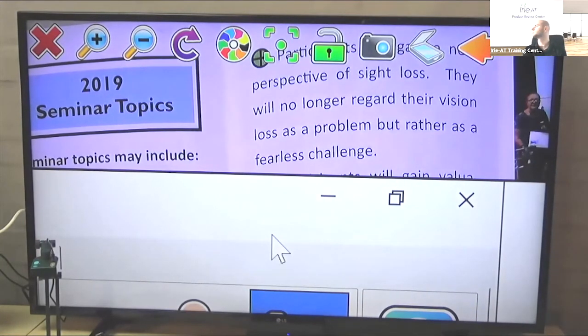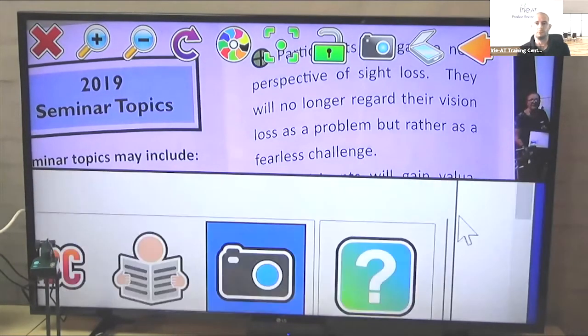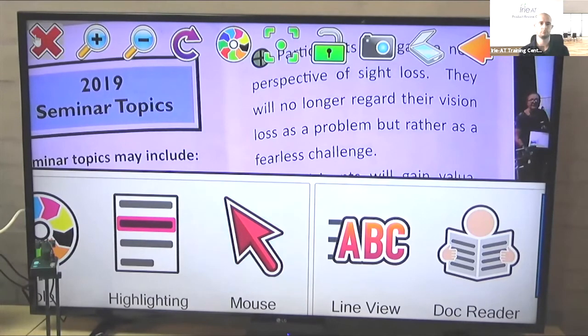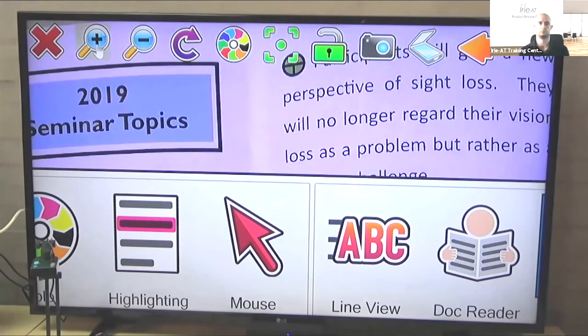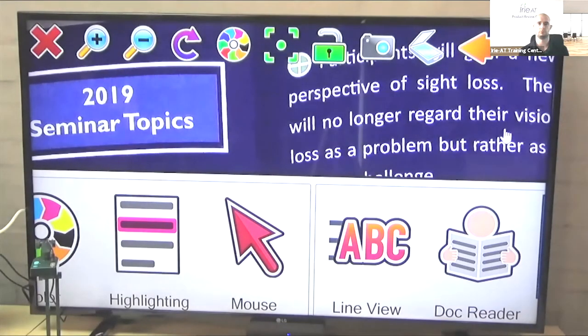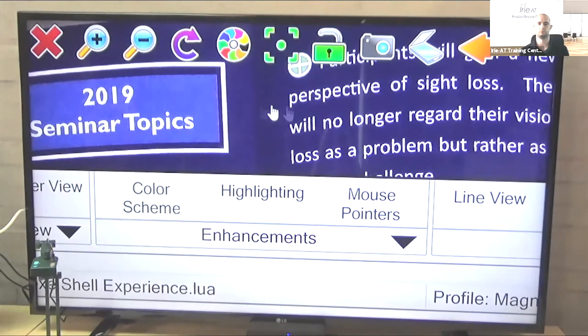On the top, I've got my live magnification. On the bottom, I've got my desktop. I can still be doing work and reading something else. If I don't have a touch screen, what I do is I press caps lock and the middle mouse button, and that'll move me up here. And now I'm up here where I can change the magnification and contrast and whatever else I want to change for this. When I want to go back, I hit caps lock and the middle mouse button again, and I'm down here. So it's real easy to move between the views and manipulate different things at different times.